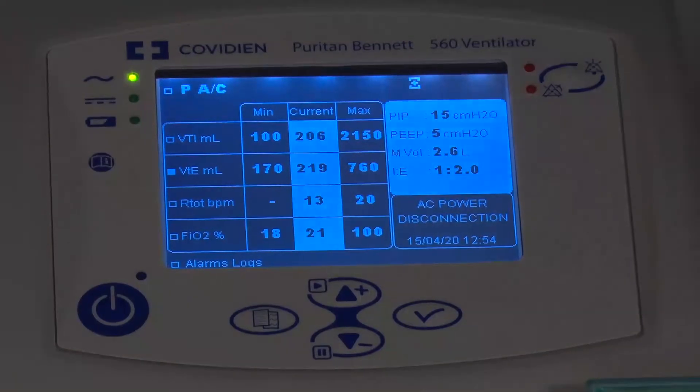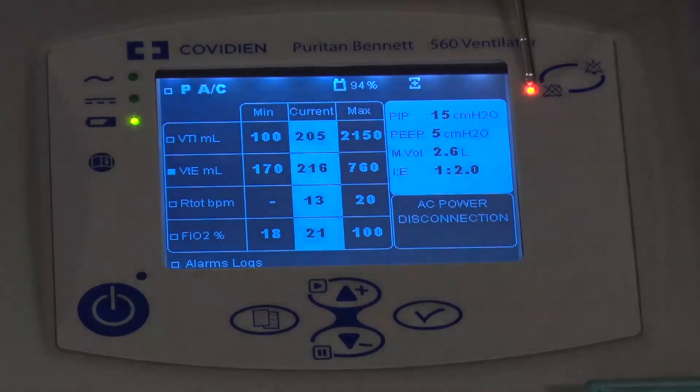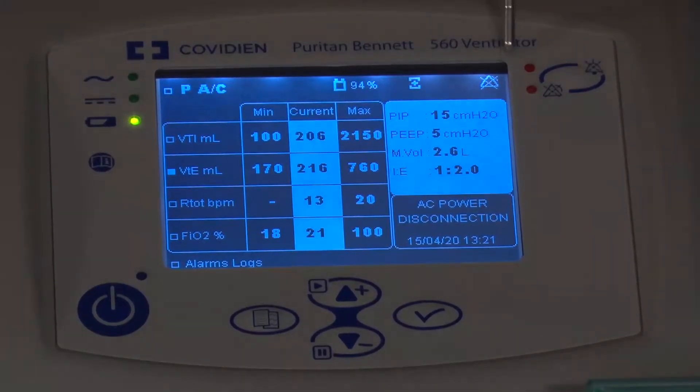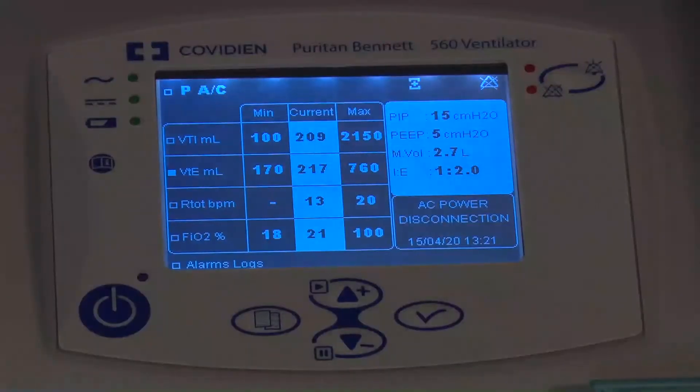I'm going to simulate a couple of alarms. First, I'll go ahead and unplug the unit. We can see an alarm flashing below — it's the AC power alarm — and a light is lit up top. Since this ventilator is intended for transport use as well, I can push the button and get a 60-second alarm silence. If I push it twice, it moves to a long-term silence mode, losing both visual and audio indicators. I'll plug it back in, and when it goes back on power, everything resets.